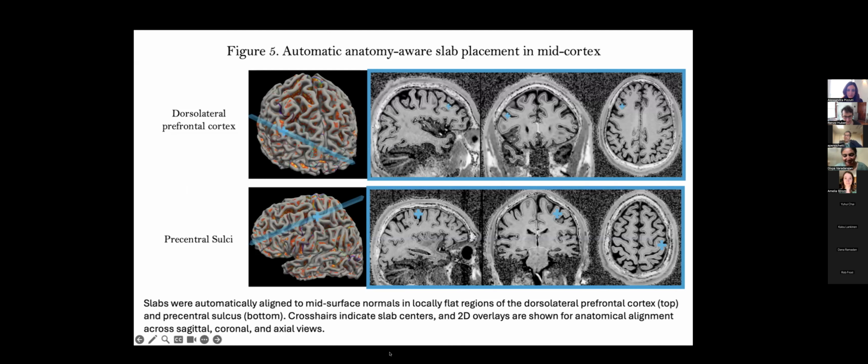Yeah. I like the dorsolateral prefrontal cortex. It's not trivial to find this on the scanner on your three projections. It would have been awesome if this method existed a couple of years ago for my study as well, where we tried to do this, and we wasted a lot of time doing functional localizers. You just have it based on an atlas.